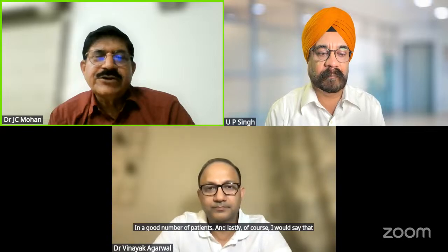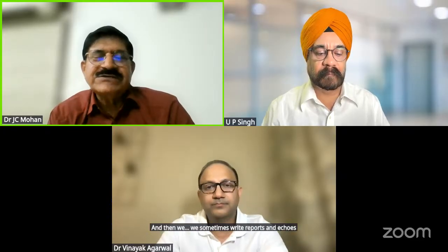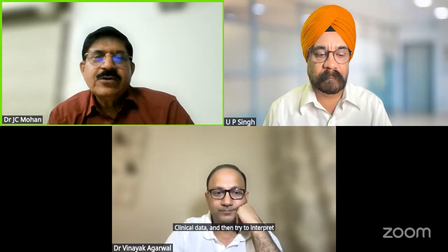And lastly, of course, I would say do not forget the clinical picture. We do everything, but we forget the clinical picture. And then we sometimes write echo reports which are incongruous. So my suggestion is look at the patient first, clinical data, and then try to interpret. And don't give dogmatic reports that LA pressure is 23.54.